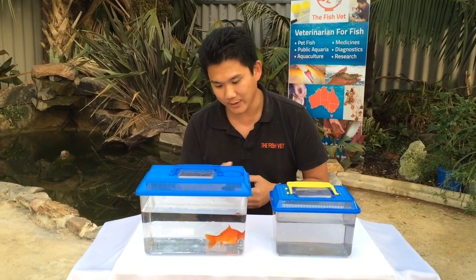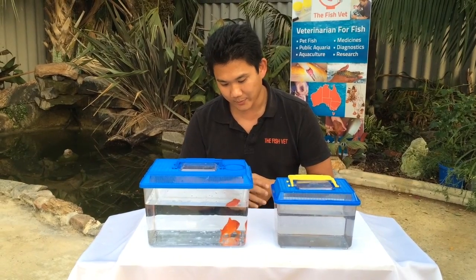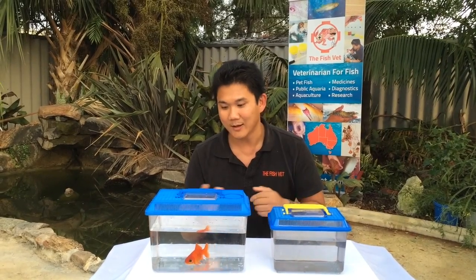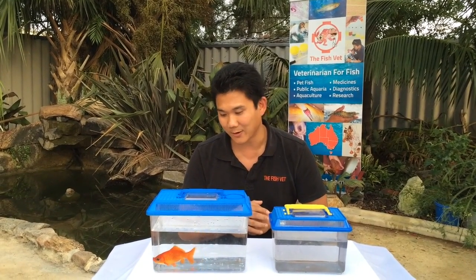With the surgery that we're going to do, it's going to be a pretty gross type of surgery. So if you've got young kids and you're not used to blood, it might be a good idea to turn it off now.